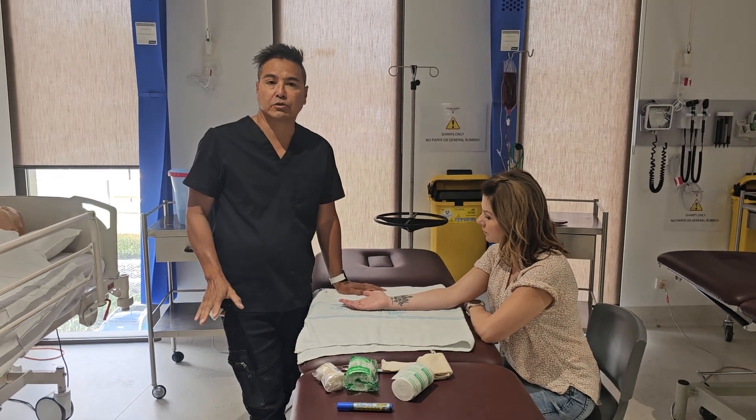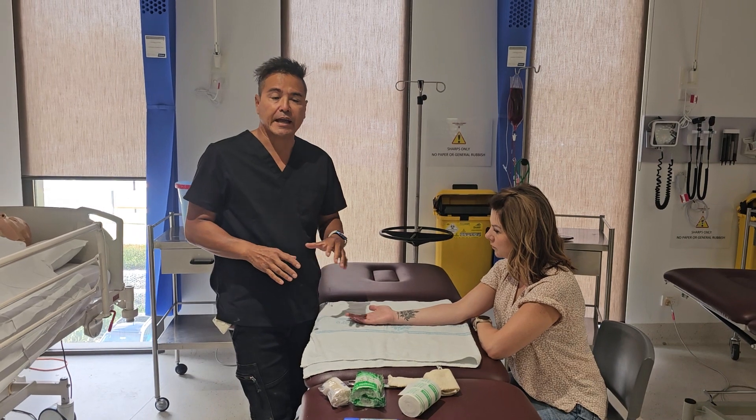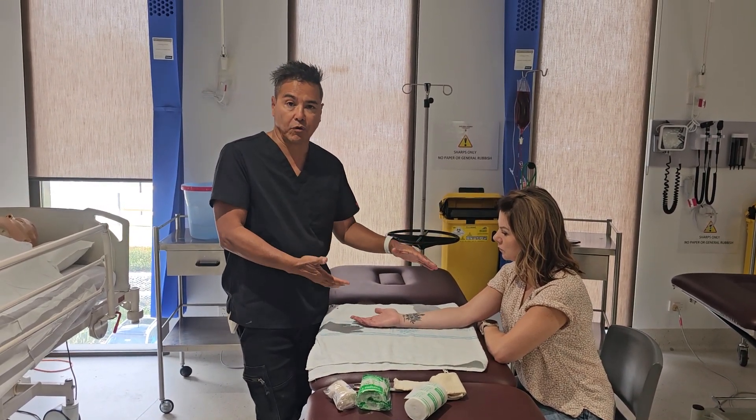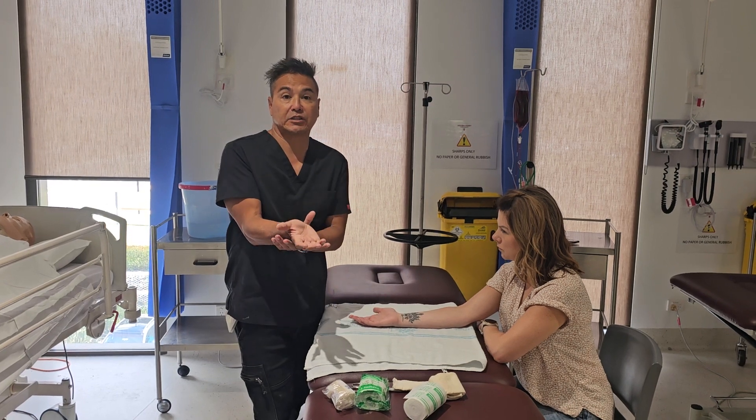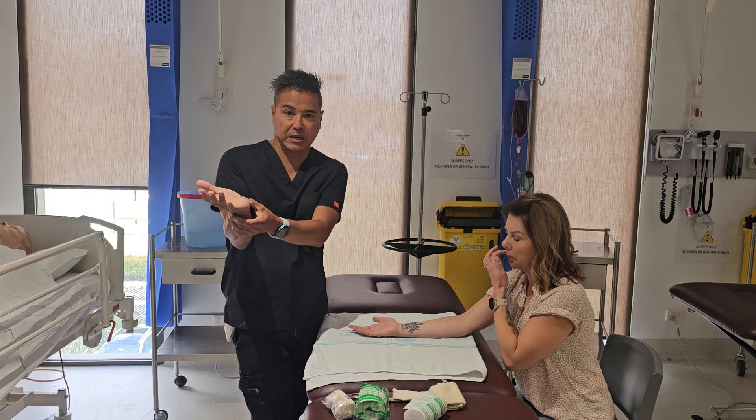I just thought I'd do an up-to-date video on how to apply some plaster. What we're going to do here is apply plaster to Rachel's forearm to simulate the fact that she may have a fractured wrist, and we want to immobilize the joint.